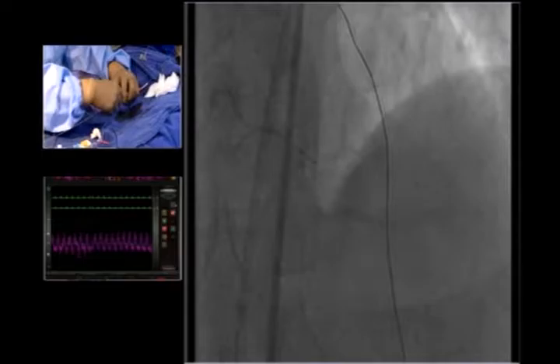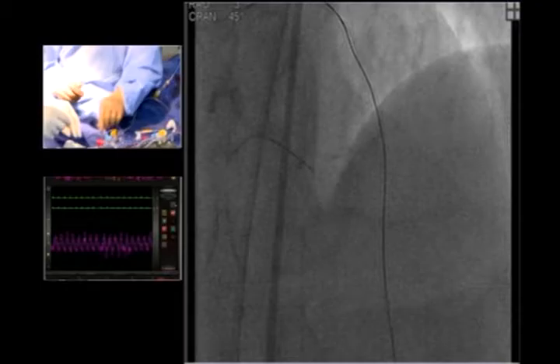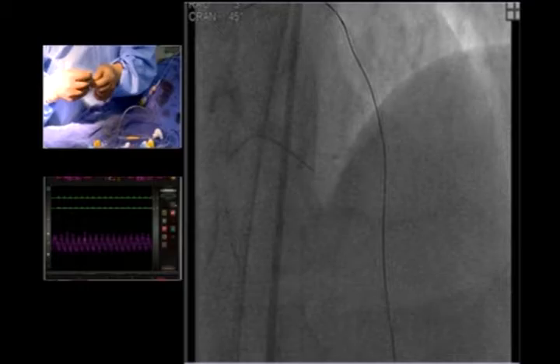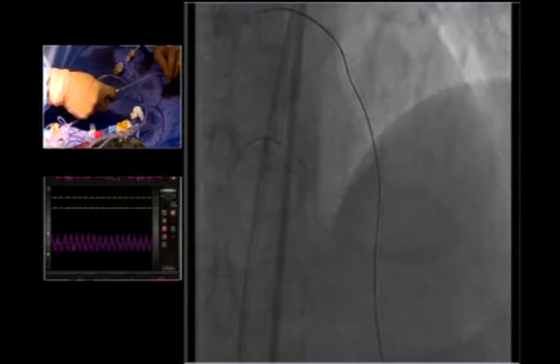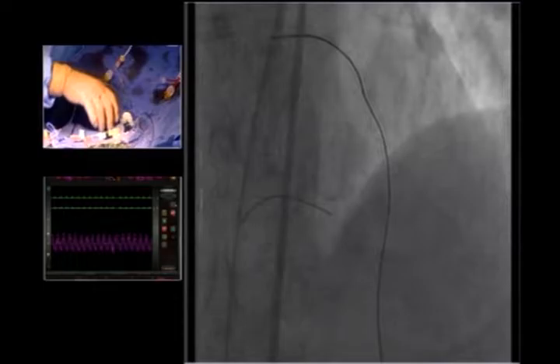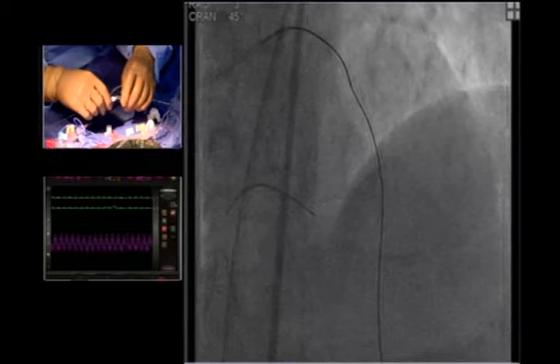Can I see the tip of the wire? Okay. Okay, detach. Yes. So again, we'll watch his hands as he spins this Tornus down. This is an interesting device. It's a corkscrew device where he's going to spin this 15 turns counterclockwise. Yes, counterclockwise, yes. It's very important.